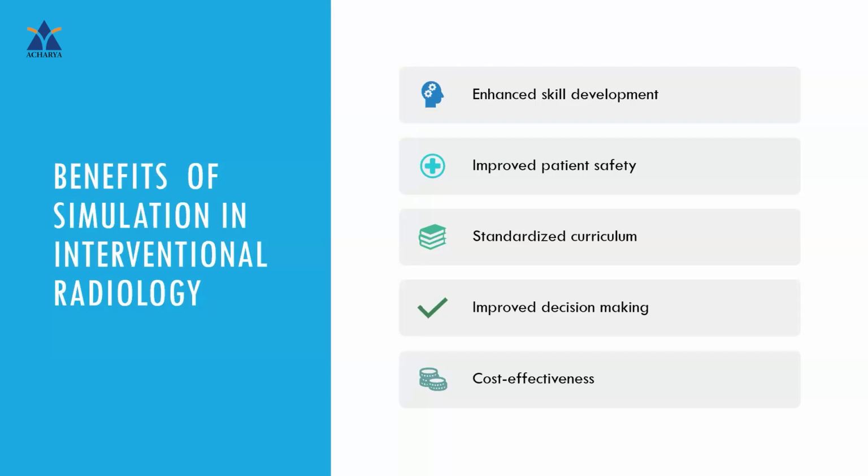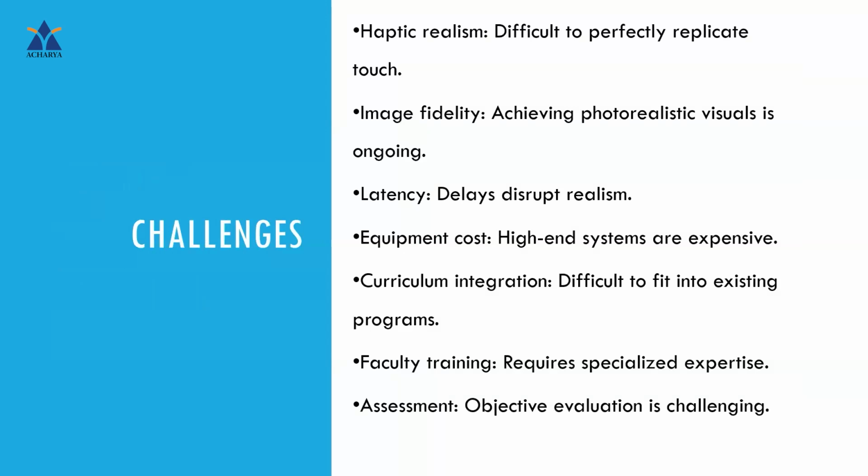Simulation provides a consistent platform for training, ensuring that all trainees receive standardized instruction. It also helps in making better decisions in stressful situations, and it is cost effective when compared with animal models and cadavers, which you have to spend a lot of money on. Simulation is a relatively cost effective training method.